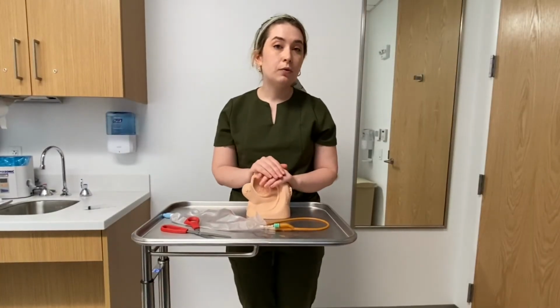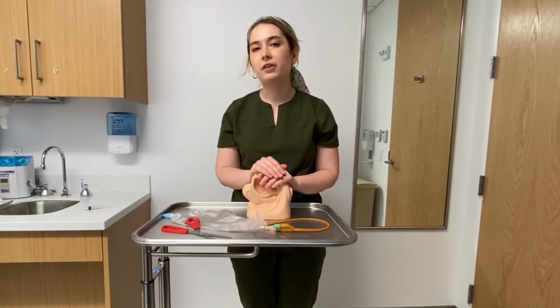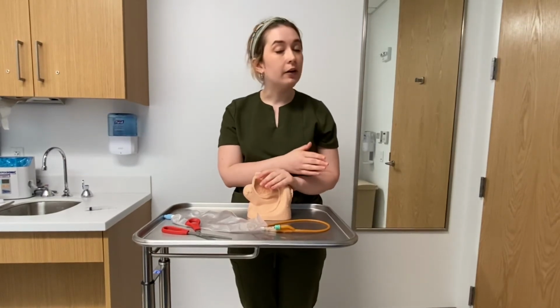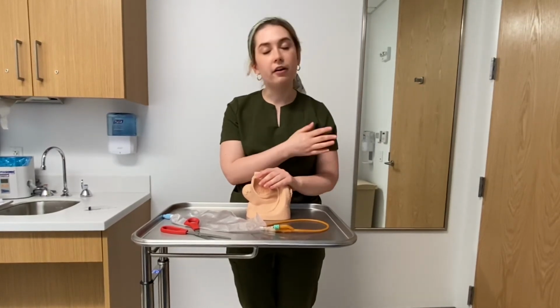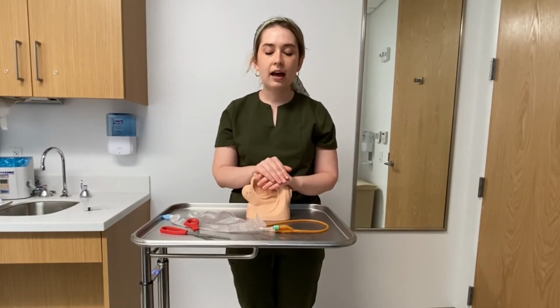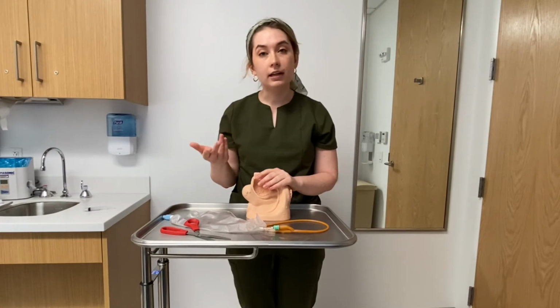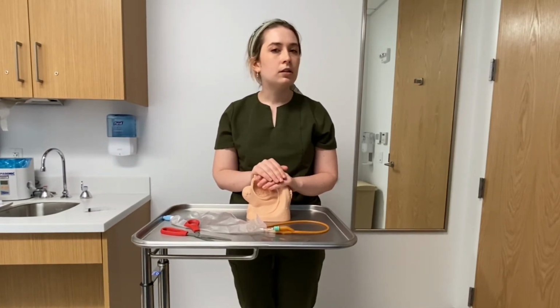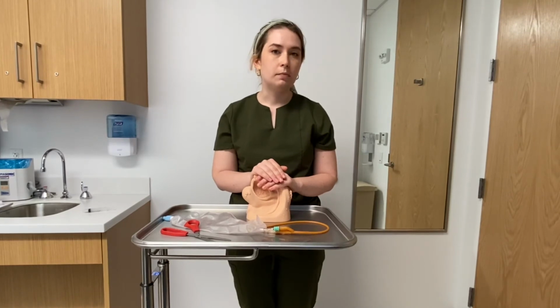On the day that you remove your catheter, we usually advise you remove the catheter in the morning and make sure you are hydrating very well from before you remove the catheter and as the day goes along. If you have not urinated and you are hydrating well within about 4 to 6 hours, we advise you to either call the office or go to your nearest emergency room.